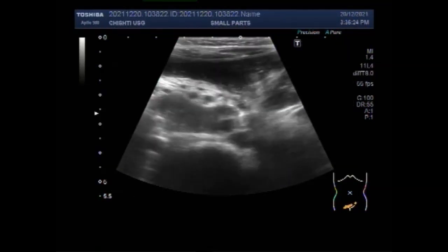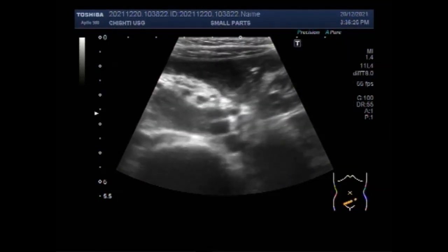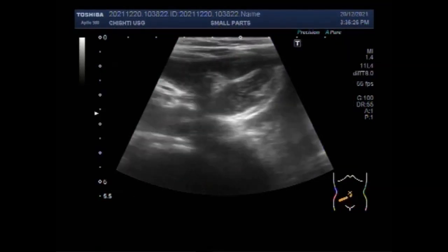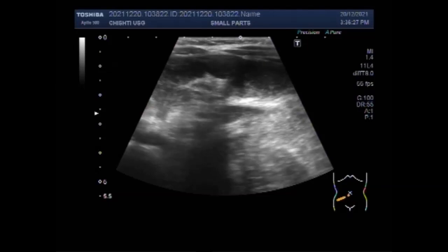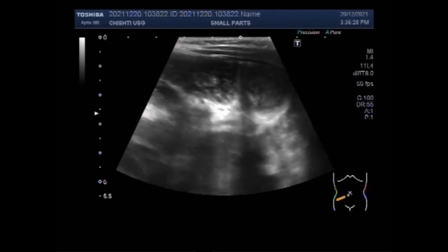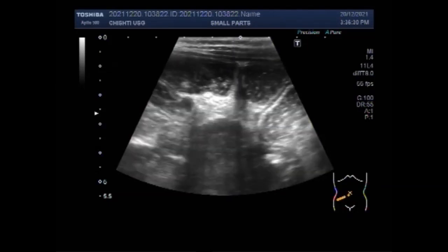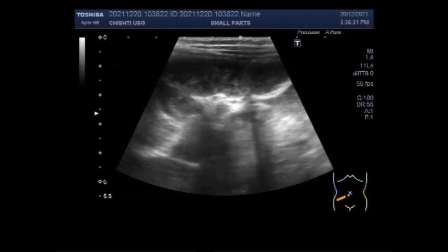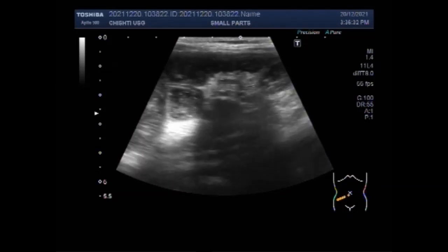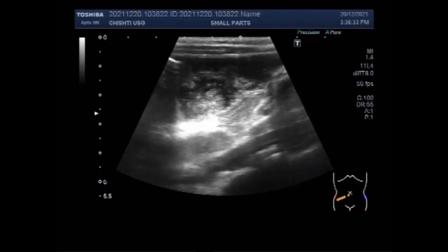Dear viewers, I hope you are all fine. This CERTA sound video shows dilated gut loops with intestinal obstruction in a female child of about 10 years.